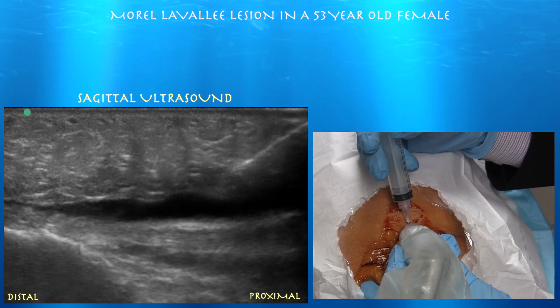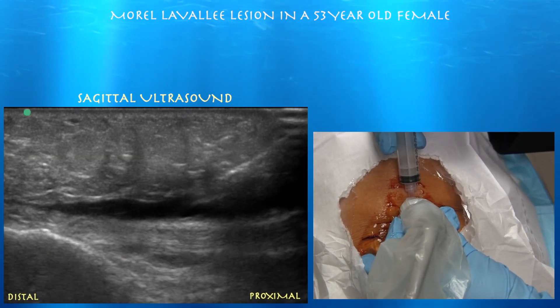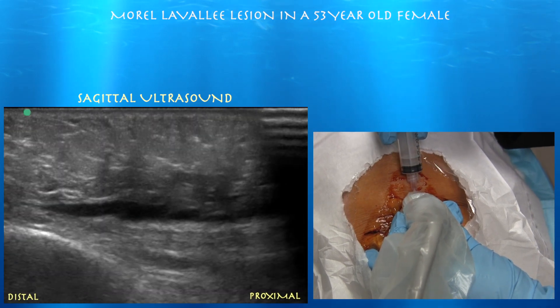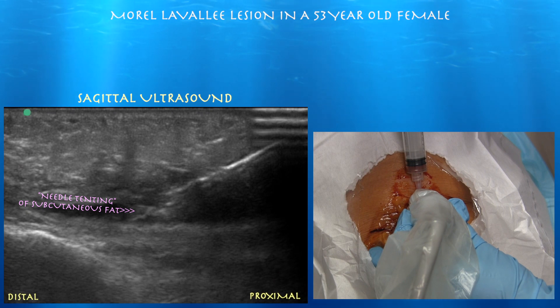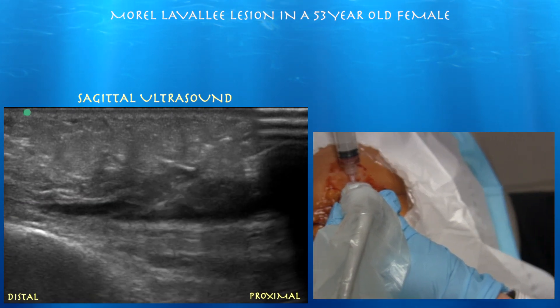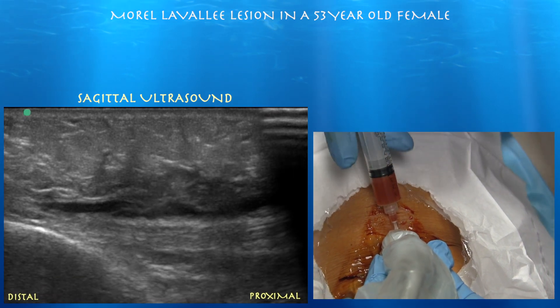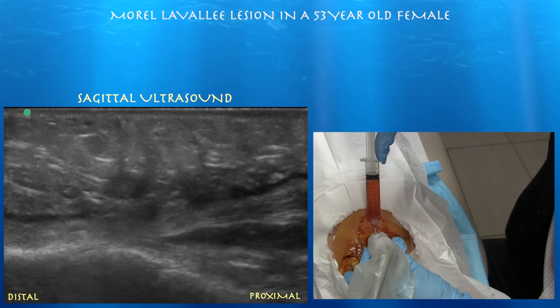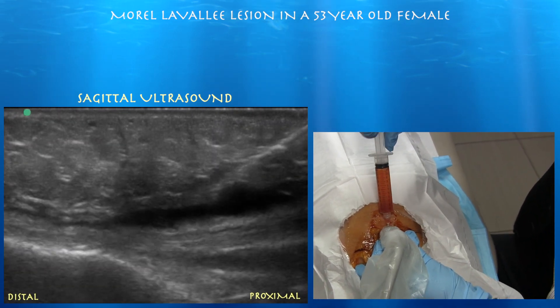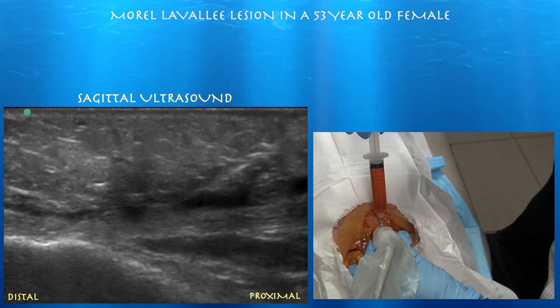Here we are going in trying to drain this fluid collection. It doesn't want me to break through — sometimes the tissue is just catching on the needle. It's interesting that even with a sharp needle it can be hard to get through where it needs to go; sometimes you've got to give it a little jab. That's where ultrasound comes in handy, because you don't want to jab it into the patella tendon unnecessarily. You can guide it carefully and poke it into the fluid collection.